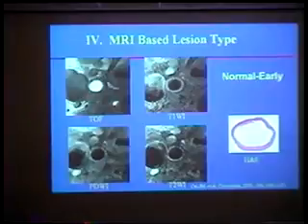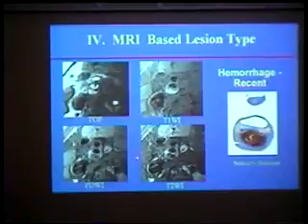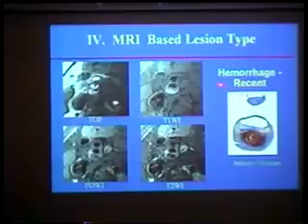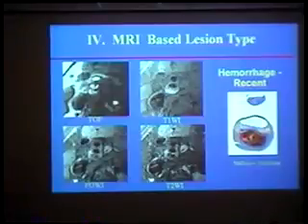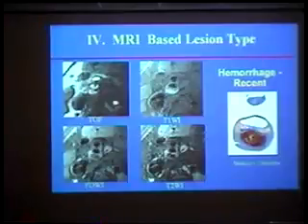That's a sign of a relatively normal artery. And then you can also look at almost the other side of this, the more advanced lesions. This is a type 6 lesion in the AHA definition. This is what the histology shows of what this looks like. The major part of the lesion is intraplaque hemorrhage. And then there's a cap actually formed here that is not very uniform, but it definitely exists.